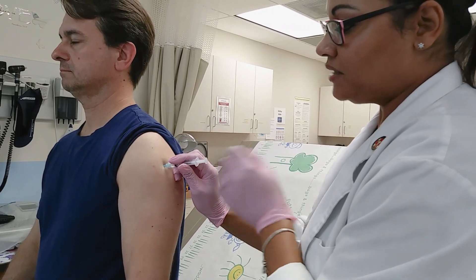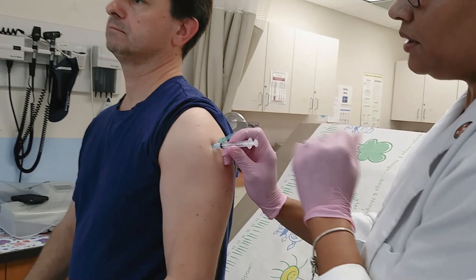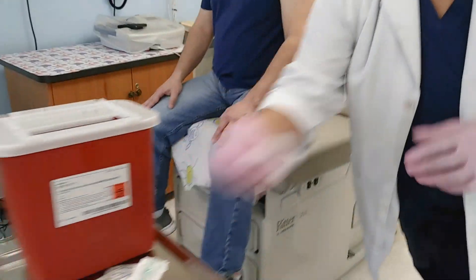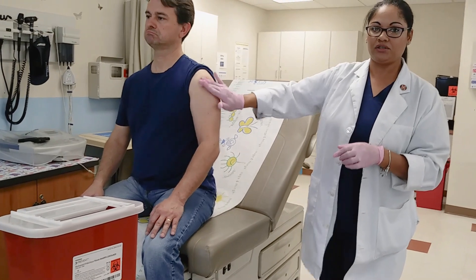We're going to make sure we aspirate — pull back just a little — and then go ahead and inject and come straight out. Do not use your hands to close your needle; we want to go straight to sharps. Give a little bit of a massage to get that medication working in a little bit faster.